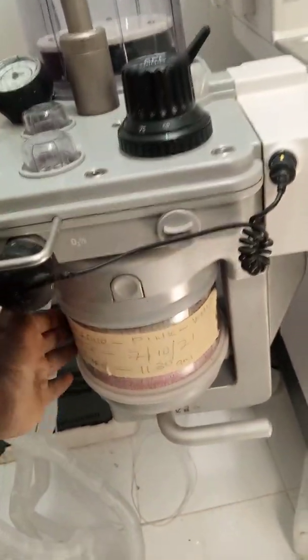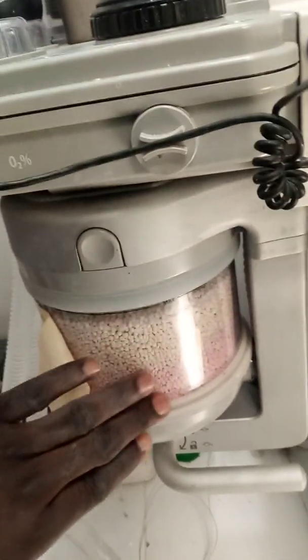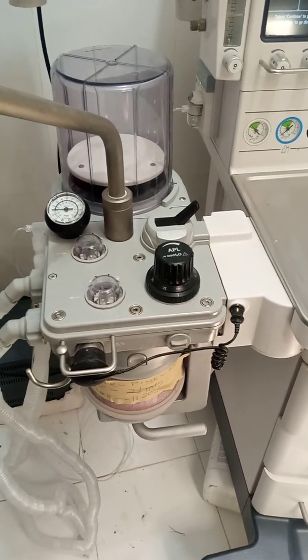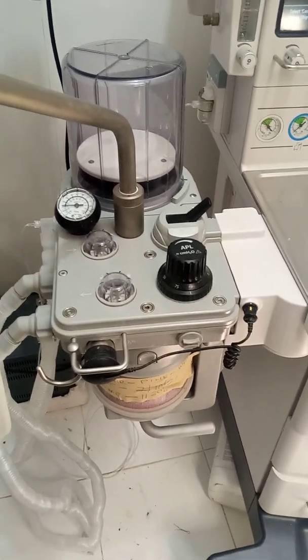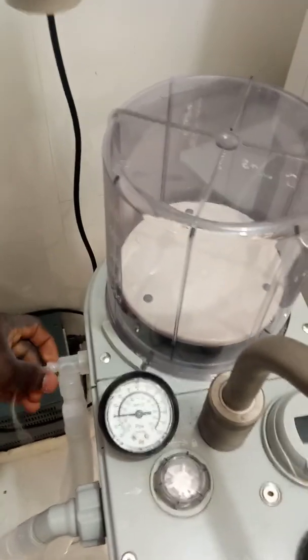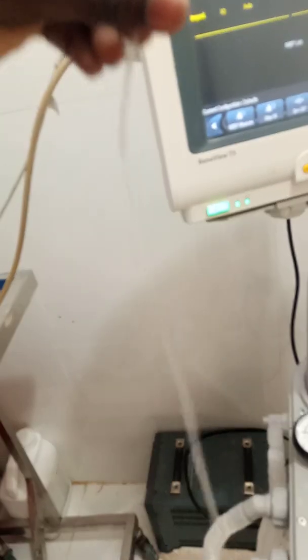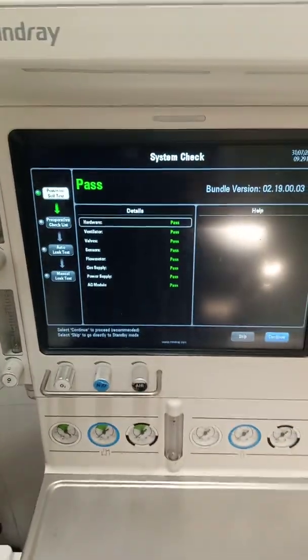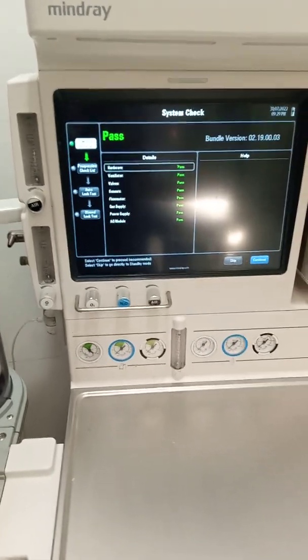Let's talk about the carbon dioxide absorber. This canister you see right here is the carbon dioxide absorber. What it does specifically, as the name suggests, is it absorbs carbon dioxide from the exhaled air coming from the patient. This helps to prevent the patient from rebreathing the carbon dioxide that has already been expired.